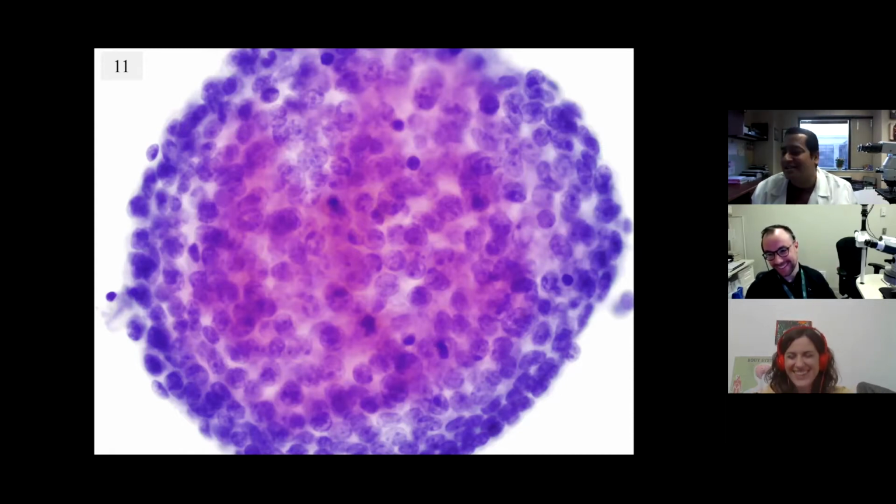Breast. Of course, it's not specific for breast to see this, but they call it in the cytology world cannonballs. And the cannonballs are supposed to be like a marker of metastatic breast cancer, a morphologic feature of metastatic breast cancer on cytology.